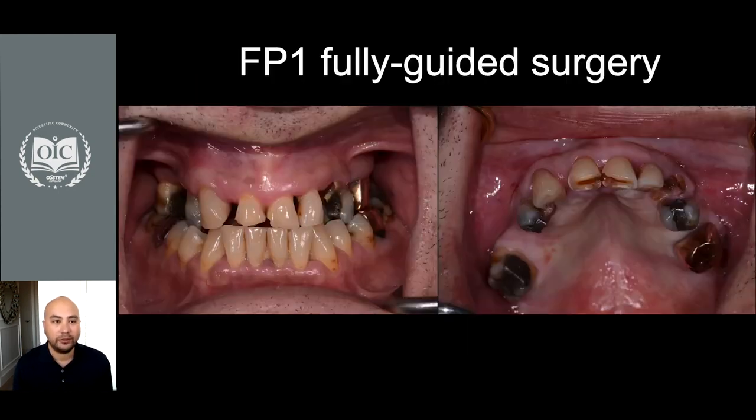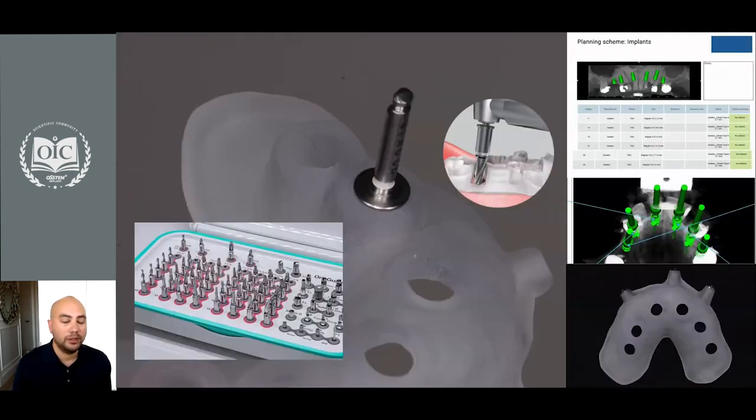And nowadays we have fully guided surgery protocols available with the guide kit.